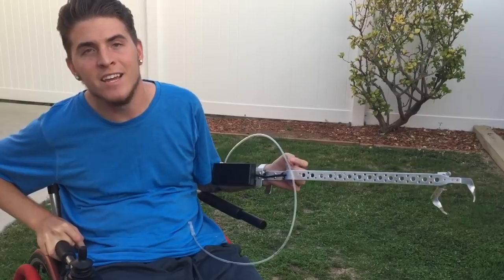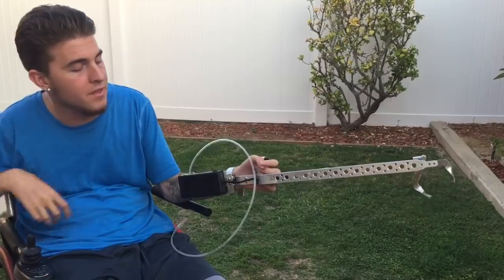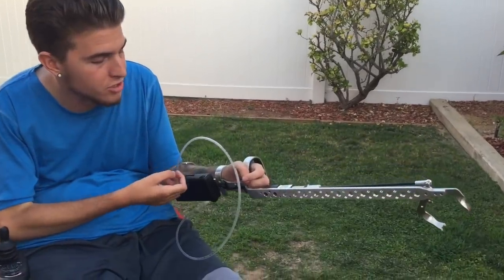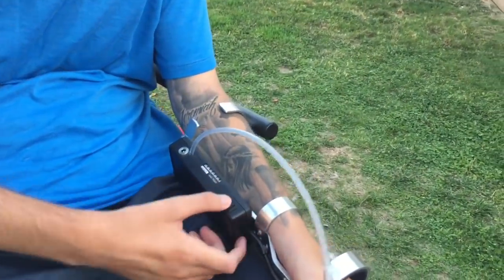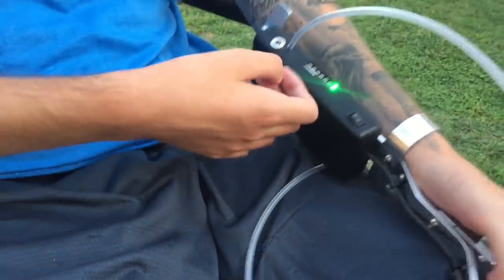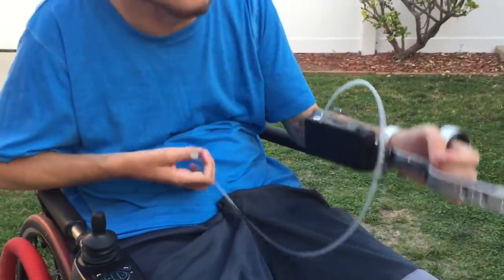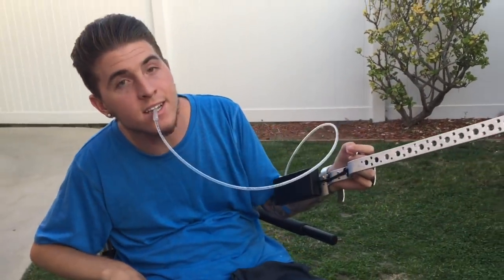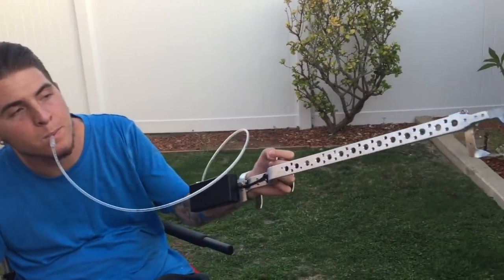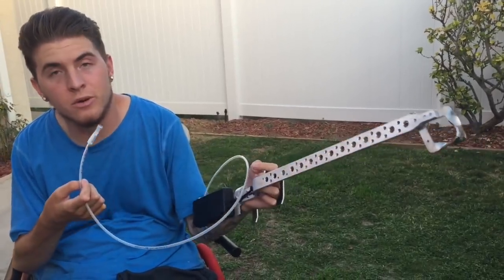I want to go ahead and put it on and show you guys how it works. I moved outside for better lighting. So this is what the sip and puff reacher looks like, and this is where the battery is. I'll push the on button right here — there we go — and then the green light will turn on. Now I'll put this plastic piece in my mouth, and if I suck it closes, and once it's closed if I blow into it it's going to open it.